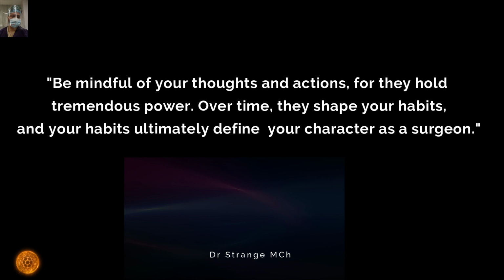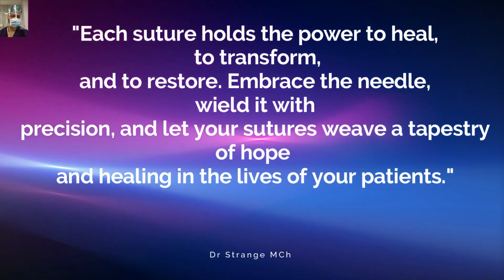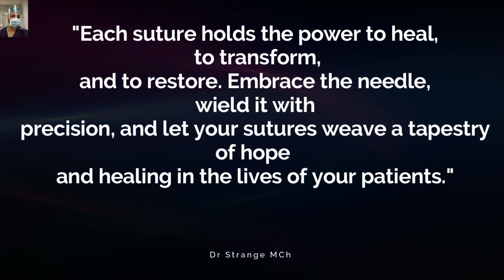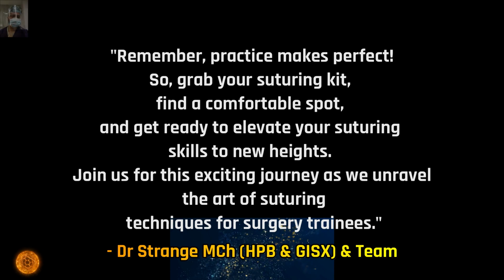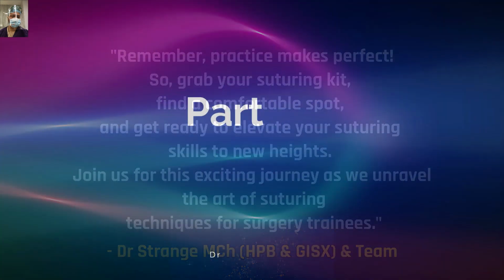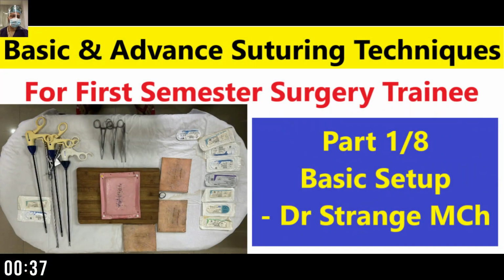So, friends, whether you are a medical student, a resident, or a surgery trainee, mastering the art of suturing is essential for your future. Sutures play a vital role in wound closure, helping patients heal and minimize complications. So it is crucial to have a solid understanding of the various suturing techniques at your disposal. This video series has been designed for a first semester trainee. So we will basically break down each technique step by step, providing detailed explanation and tips to ensure that you are able to master them effectively.